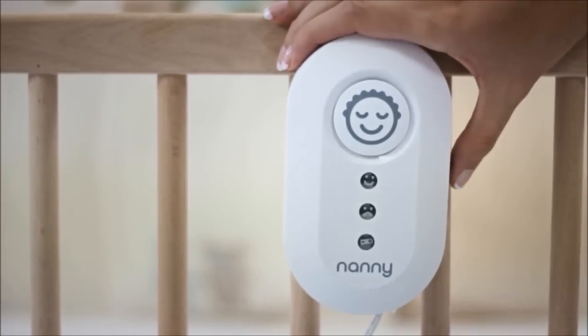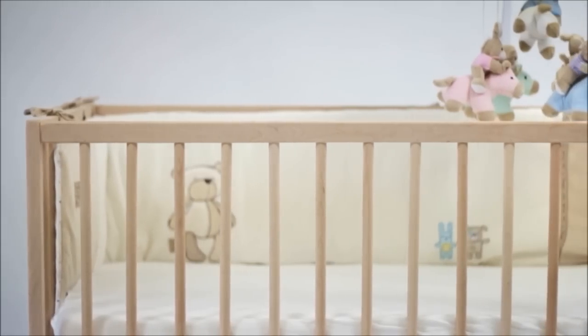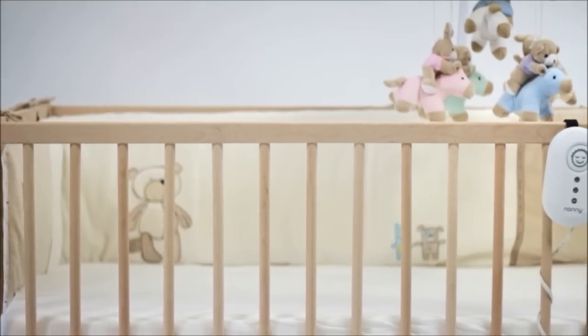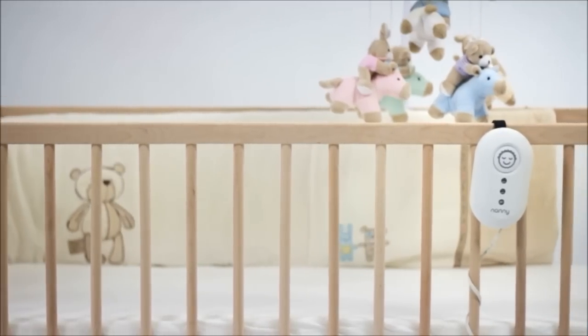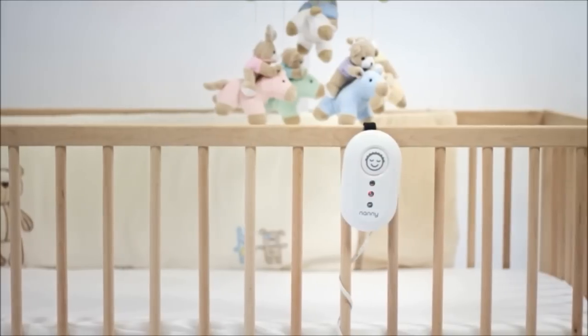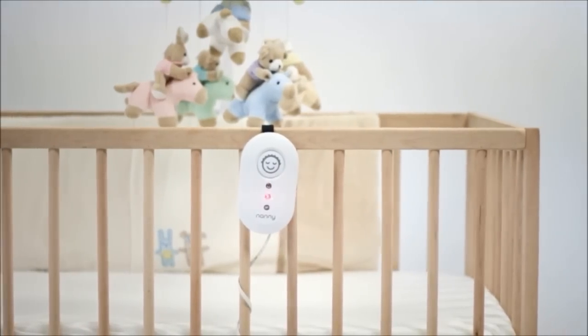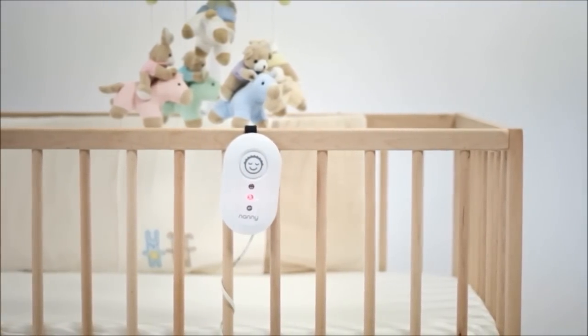All the LEDs will blink briefly — Nanny checks the battery status this way. After the beep, the device monitors the presence of a breath. If Nanny detects no breath for longer than 20 seconds, a red warning LED will blink, and after 5 seconds a loud acoustic alarm is triggered. As you can see, you can be sure that your baby is being watched carefully.